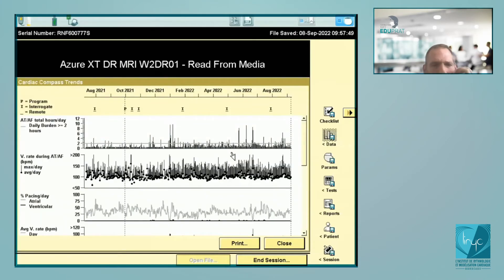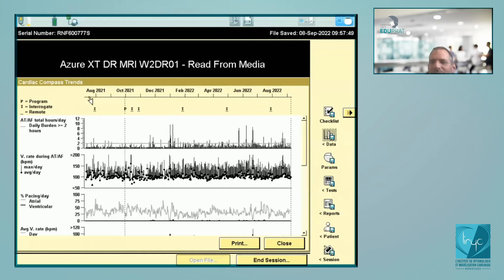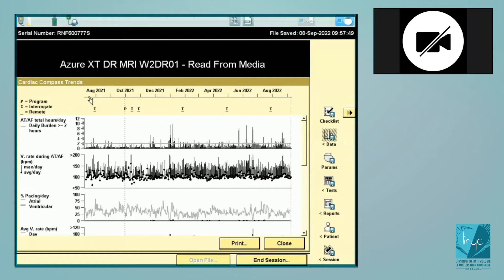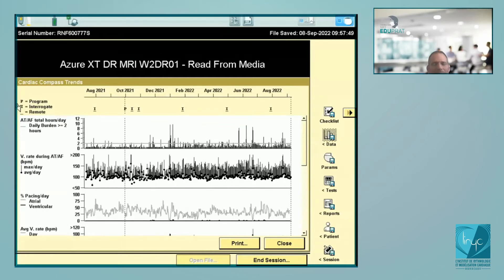The next step is the Cardiac Compass. On top you have markers 'I' and 'P.' What do they mean? Camille answers: if it's underlined it's an interrogation via telecardiology — remote monitoring. 'P' means a physical interrogation with the programmer where you modified or reprogrammed something.